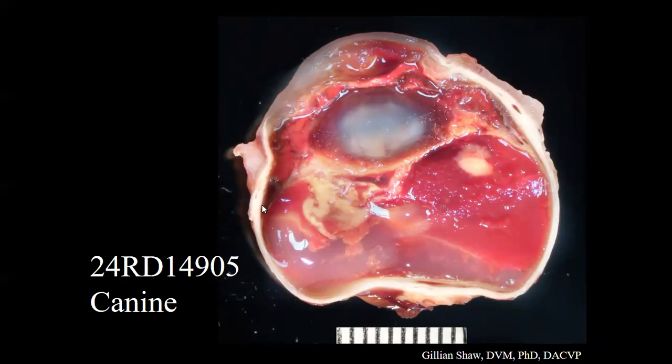Alrighty. Next case is an eye from a 10-year-old Dalmatian, spayed female.